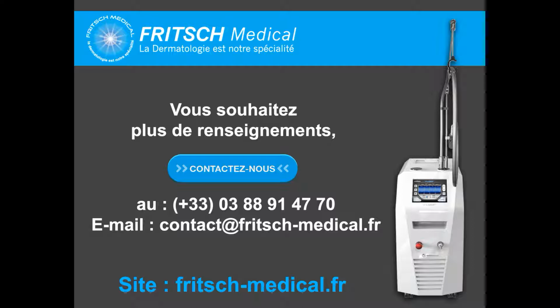It's difficult for a very light dark spot. Very light. It's better to treat with a pico or a nano laser. But for a dark spot, when it's brown, it's okay. On very superficial, you have to be sure with the dermoscopy that it's not cancer. That's first point. But after that, you can destroy very easily the superficial dark spot in one session.